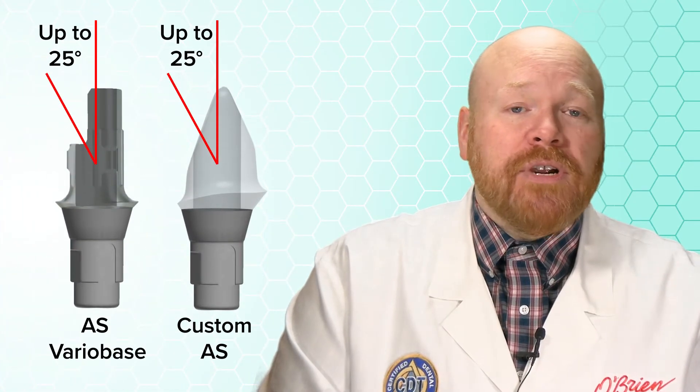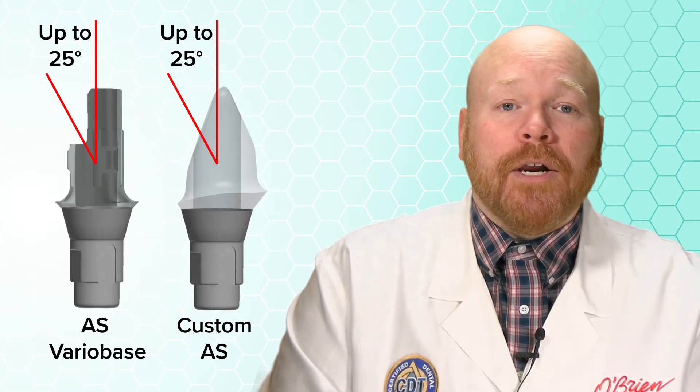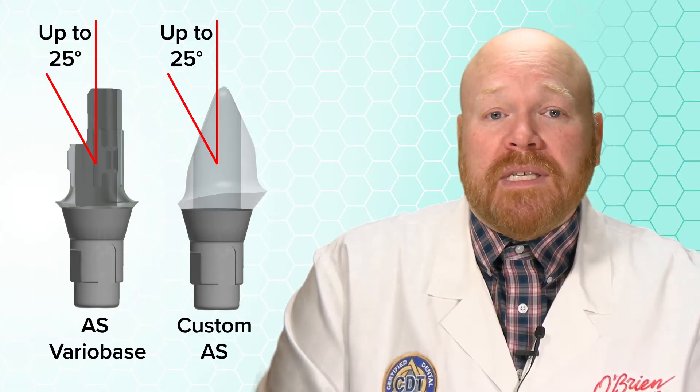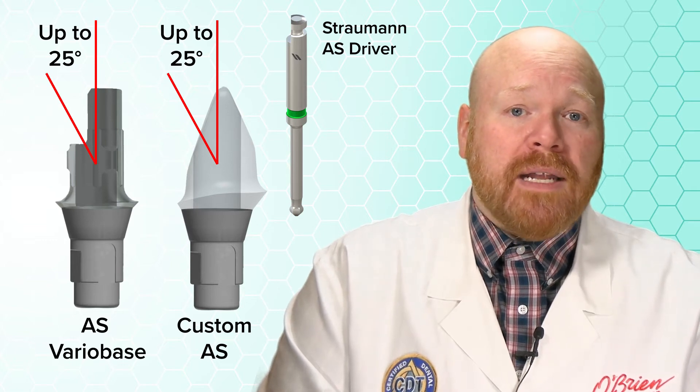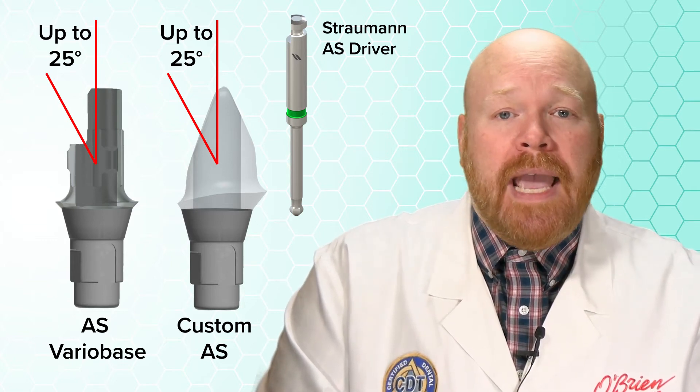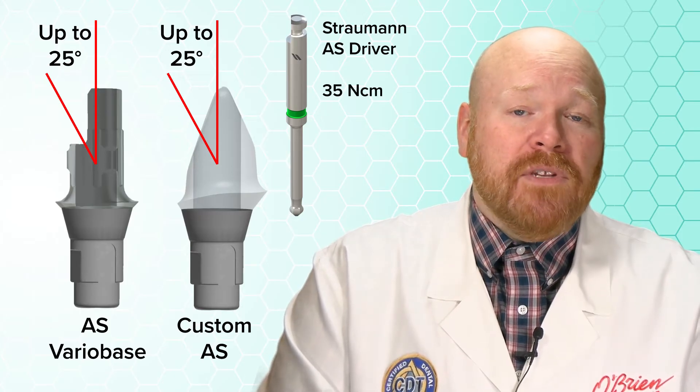The maximum angulation of the screw channel is 25 degrees, which is the same as the AS VarioBase abutment, so no changes there. These abutments do use the same AS driver that's used with all of Strauman's other angled screw channel products. Just like the AS VarioBase, the recommended torque for these abutments is 35 newton centimeters.